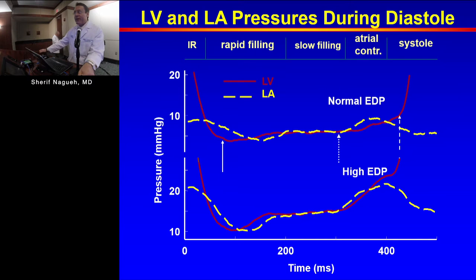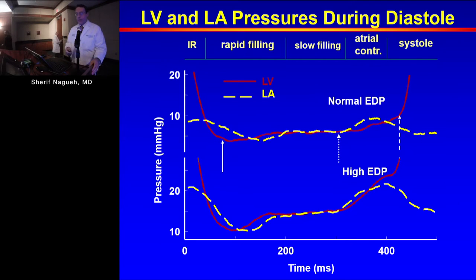We'll talk about assessment of diastolic function, something that is done routinely and frequently. It's good to start with a basic understanding of what determines the signals that we acquire, and then we move on to look at these signals and their application in different diseases.